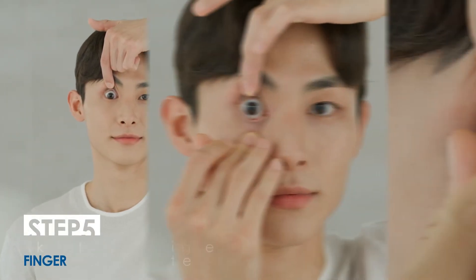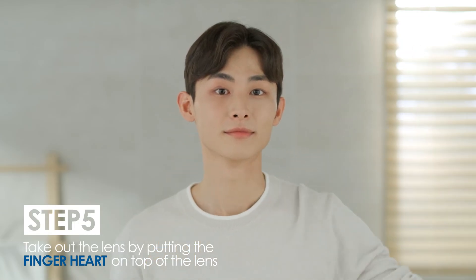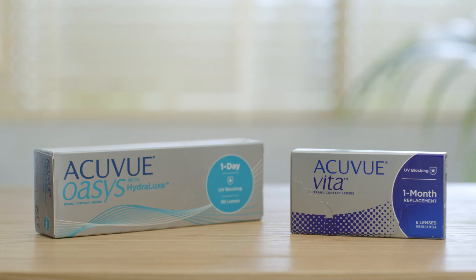Hold your lower eyelid with your finger and take out your lens with the finger heart. Wasn't that easy?